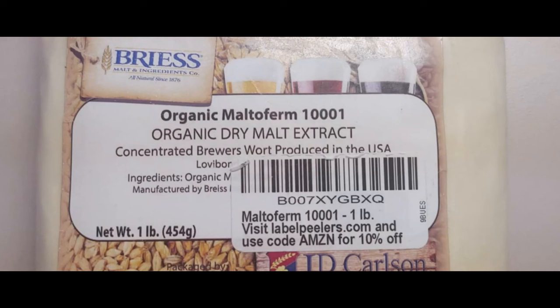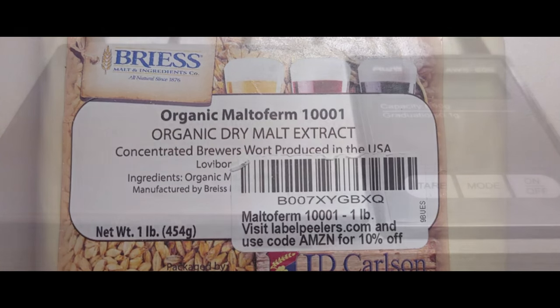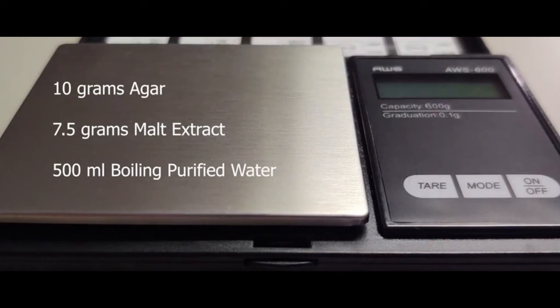We have since come up with a standard MEA recipe that works to promote the onset of rhizomorphic growth while reducing the chance of contamination by using 10-gram agar, 7.5-gram malt extract to 500 milliliters of purified water.